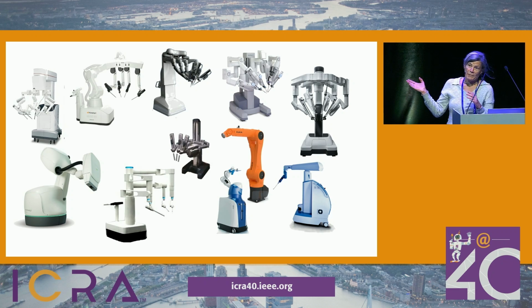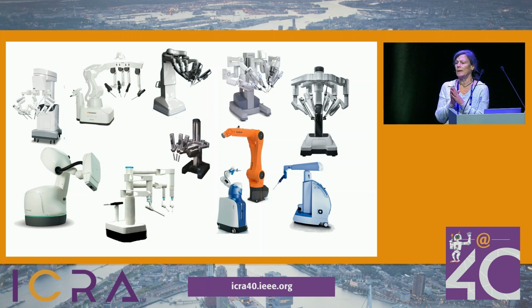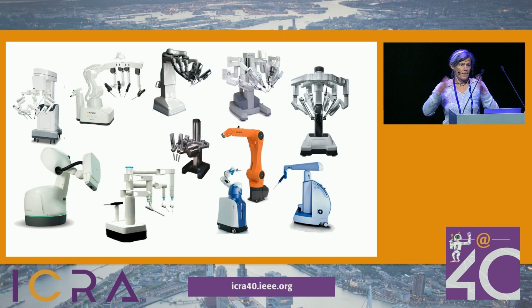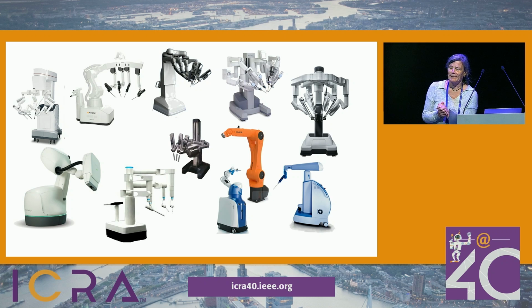Some of them have only 1 arm, like for radiotherapy or for orthopedics, but in laparoscopic surgery, for example, we need more arms, and the standard has become 4 arms.